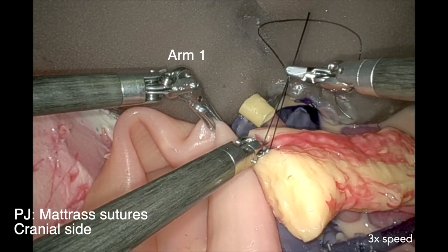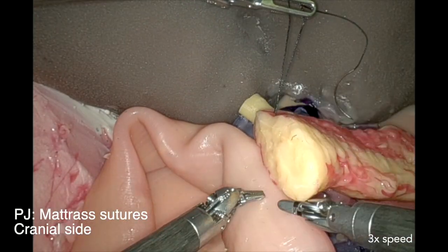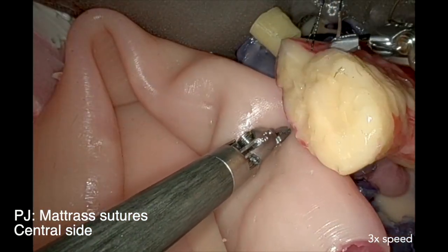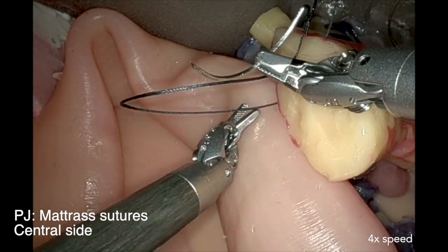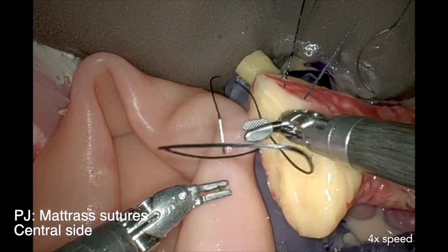Arm one will hold this cranial mattress suture to improve the exposure. Now the second suture runs transpancreatic, through the bowel, and transpancreatic again on the other side of the duct. This is the central mattress suture. Be careful not to go through the pancreatic duct.